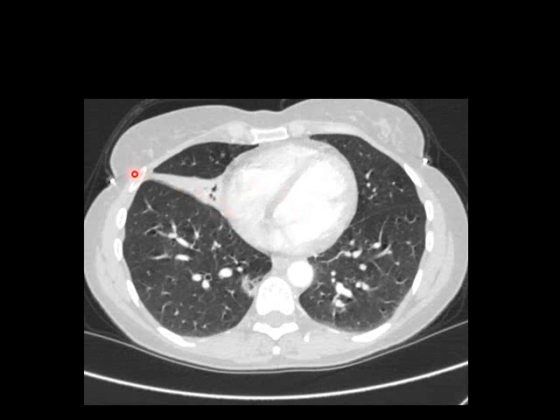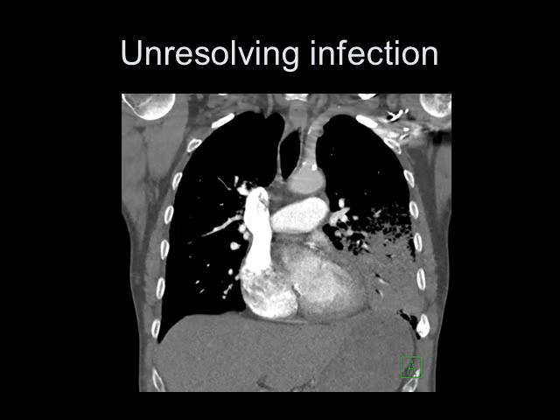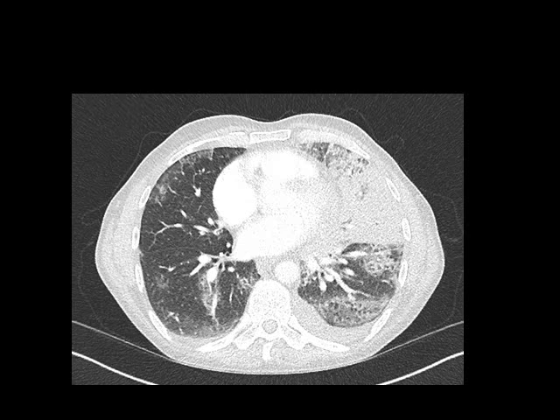In contrast, here is a patient with partial right middle lobe atelectasis where we can see the volume loss and clustered air bronchograms — sharply defined borders, extensive volume loss in the right middle lobe. Contrasting again: here's a patient with consolidation in the left lower lobe — extensive volume taken up by the abnormality, spaced air bronchograms, irregular margins, and retention of volume. At the border there's some interstitial change, because these processes do overlap.